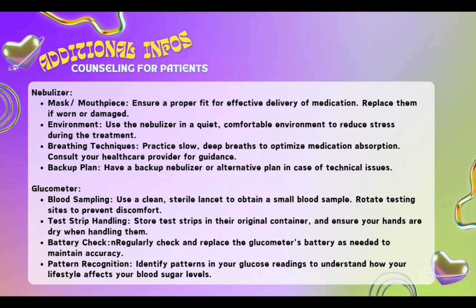And then store test strips in their original container and ensure your hands are dry when handling them. Regularly check and replace the glucometer's battery as needed to maintain accuracy. And then identify patterns in your glucose readings to understand how your lifestyle affects your blood sugar levels.